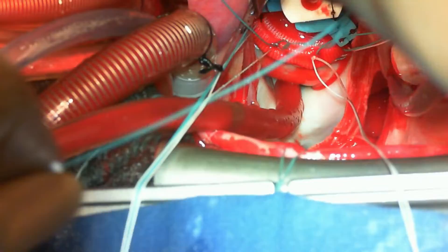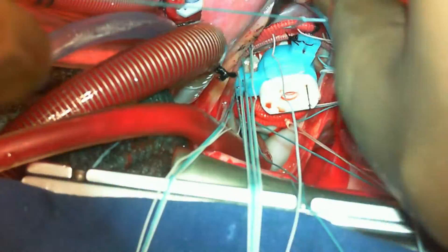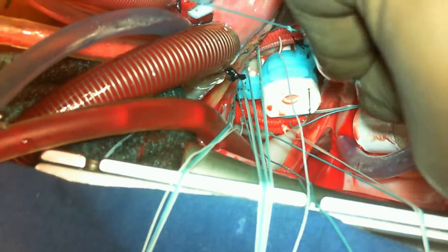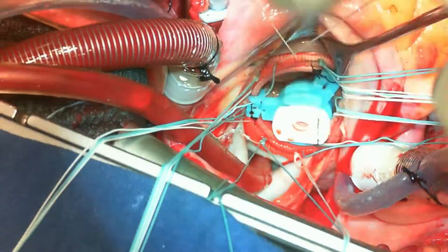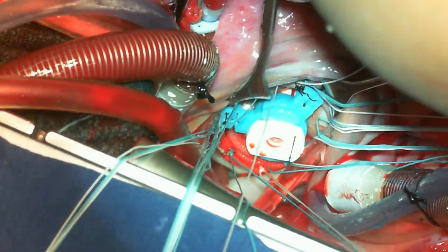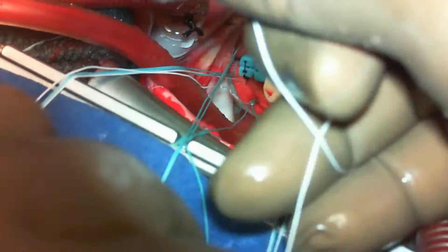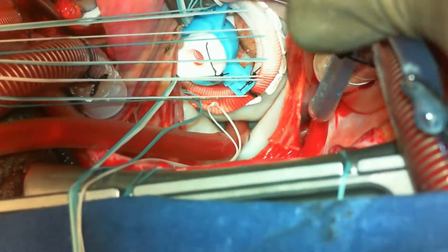There are various ways of doing this. What you're seeing here is the interrupted mattress pledgeted suture technique. One can also do the continuous technique or the simple suture technique based on the type of annulus or unit practice. Each tying method is straightforward — you have to see the pledgets before tying. Every time a suture is tied, the suture is gently put on traction, the pledget is seen, and then tied. One can follow whatever pattern the unit practices — medial side first then lateral, or lateral first then medial.